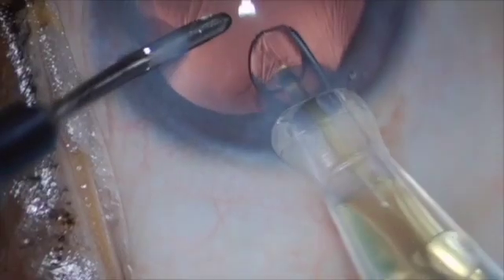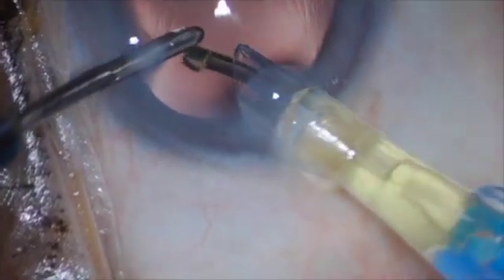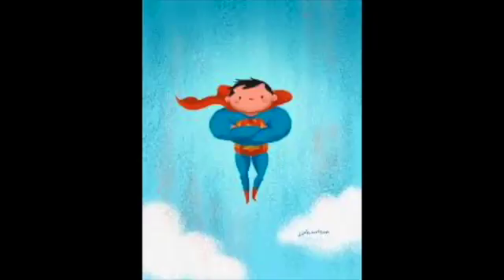We all know this IOL has a tendency of the leading haptic coming in straight like Superman and landing into the anterior chamber. We want this IOL to come in a folded way.